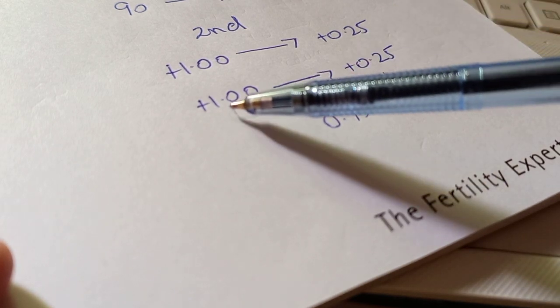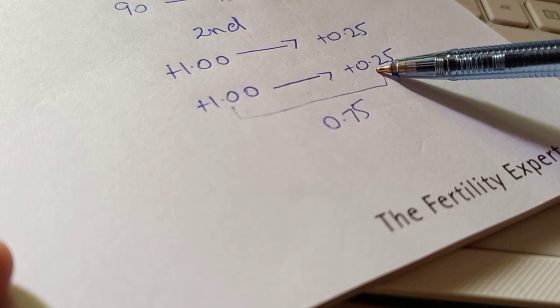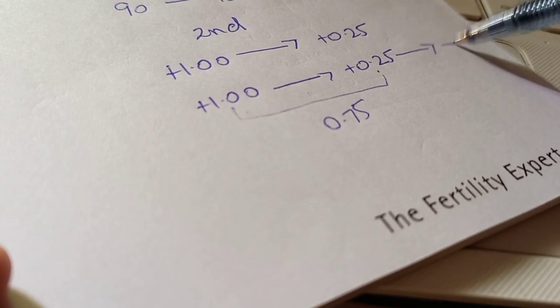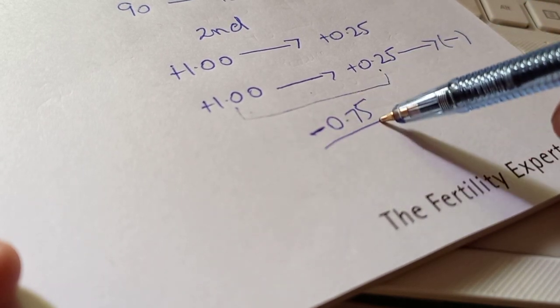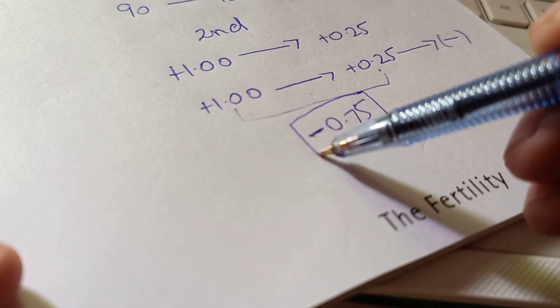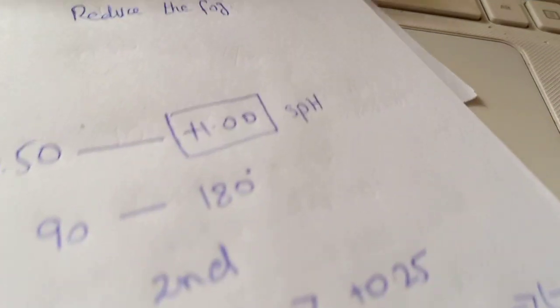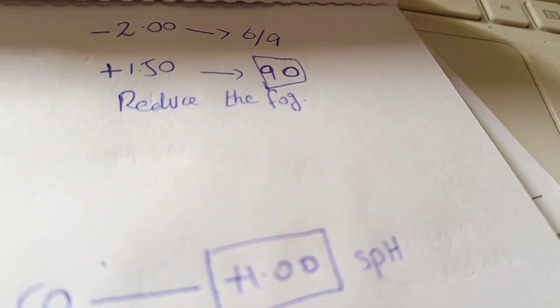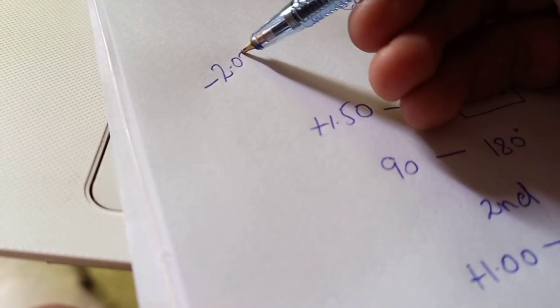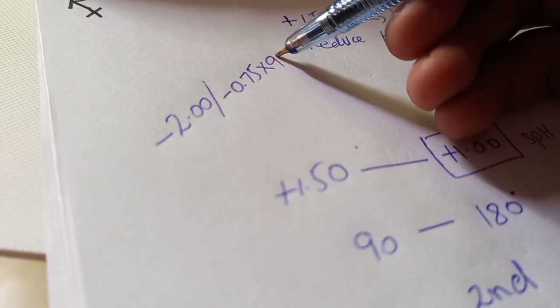Since we are moving from the bigger plus value towards the lesser plus value, we are moving in the minus direction. So the sign of the cylinder is minus, making our cylindrical correction minus 0.75. The axis of the cylinder is 90 degrees, which our patient preferred for the very first time. The final prescription is minus 2.00 spherical with minus 0.75 cylinder at axis 90 degrees.